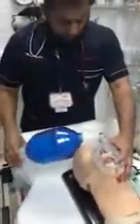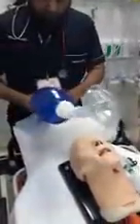Attach it to the oxygen. The oxygen will be attached from here, and use the C and E technique. This is the C and this is the E technique. You have to bag the patient.